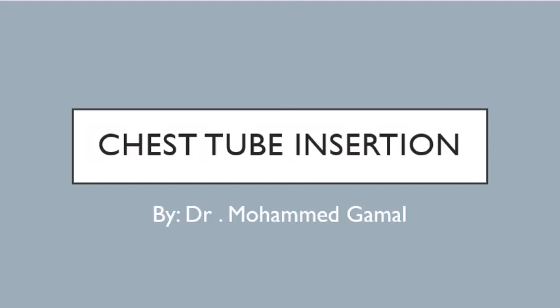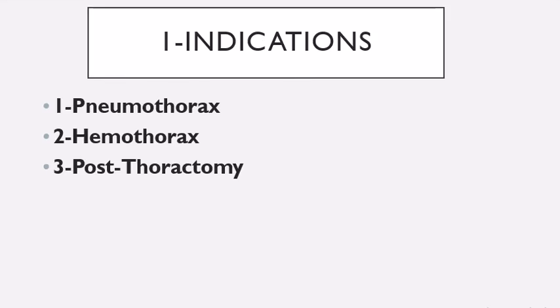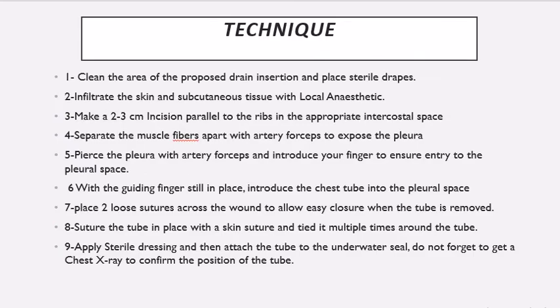Bismillahirrahmanirrahim. Today we will talk about chest tube insertion. Our video includes two parts: indications of chest tube insertion and technique of chest tube insertion. Regarding the indications, they are pneumothorax, hemothorax, and post-thoracotomy operations.